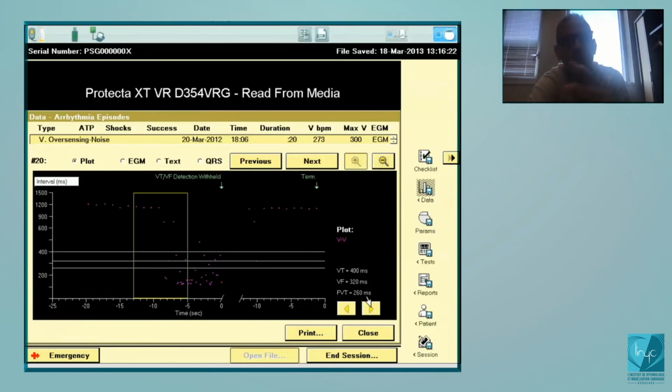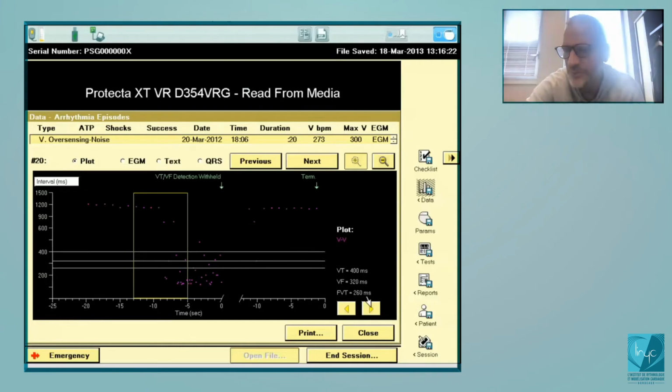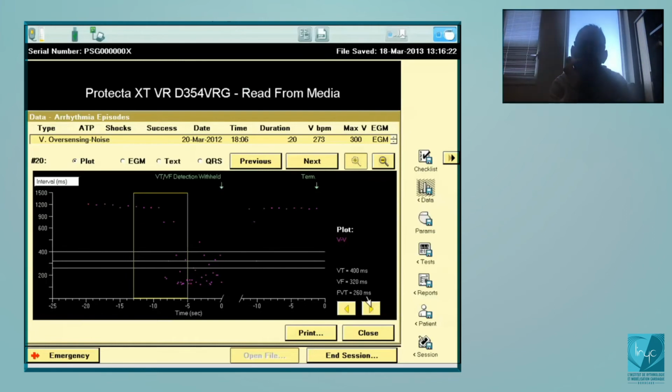It's very simple. We could discuss how it was developed, but the situation was a huge problem with Medtronic, and they had to have the possibility to integrate this algorithm in the new devices, but also in the old ones. They have done something with very simple parameters, and I really believe that it works pretty well. So, what is the concept here? If I remember correctly, it will trigger an alert if there are 2 out of 3 abnormal parameters, the first being abnormal lead impedance.